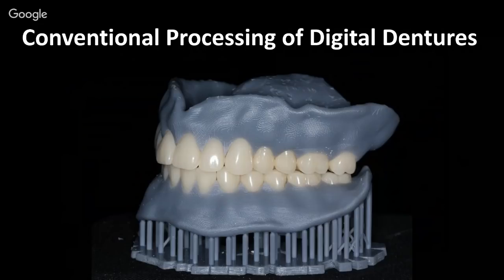Okay, can you review the best method for setting teeth and curing them with the resin that they're printed with? Yes. Okay, so first of all, you've got your denture tooth reduction coping. Adjust the teeth wherever they need to be adjusted, and then do a dry fit. Take the teeth now and make sure that you can pop all the teeth in that arch and that everything looks like it's sitting properly. So you want to verify that first of all.